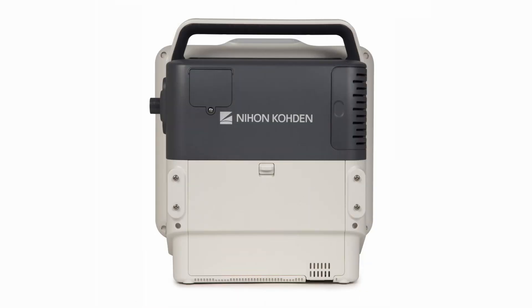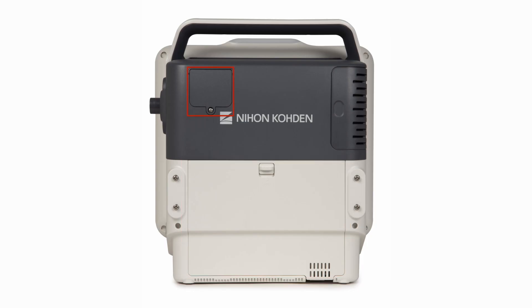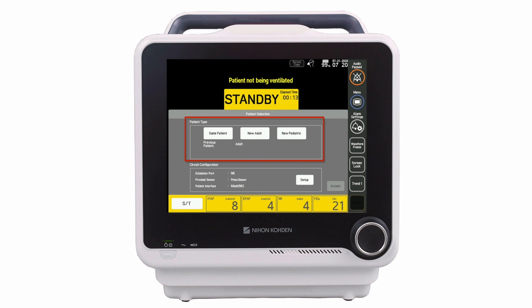On the rear of the ventilator is the main battery compartment, which contains a hot-swap lithium-ion battery, and the oxygen sensor compartment. When the ventilator is powered on, the patient selection window will be displayed and the ventilator will be in standby. In this window, the clinician selects the patient type and reviews the circuit configuration.